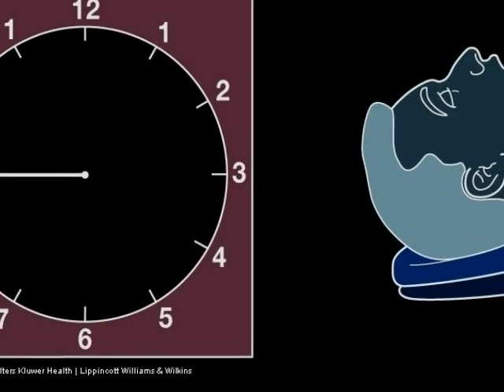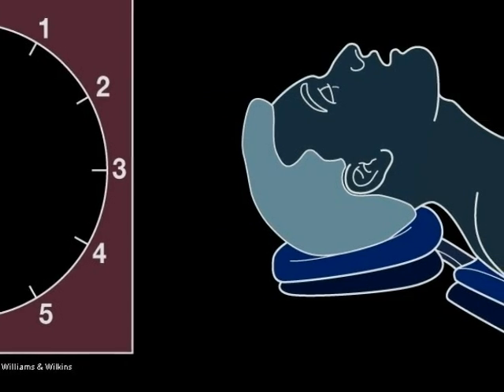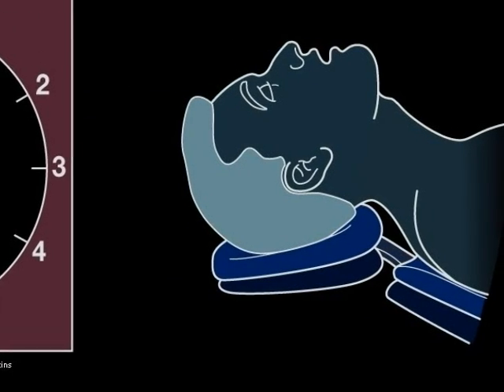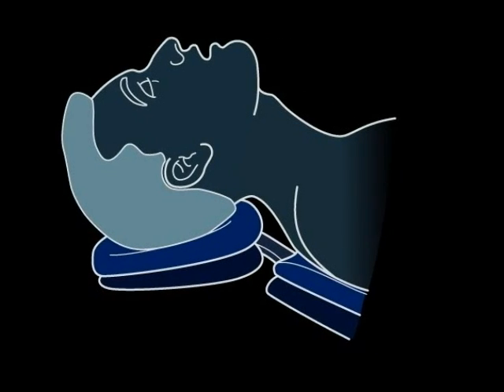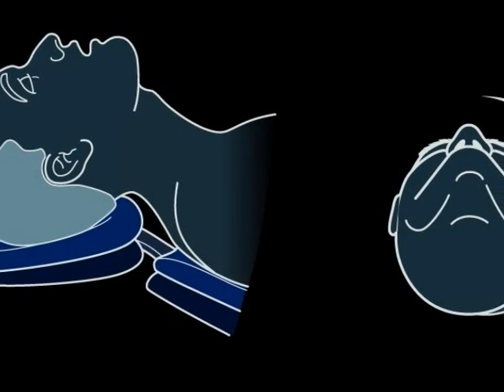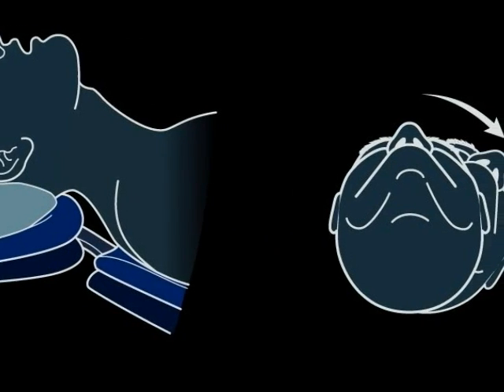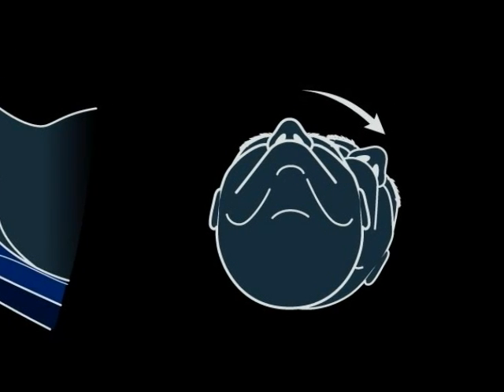9 o'clock is the position that the operator will sit for the maxillary posterior surfaces towards you. You will ask the patient to tilt their head slightly back and slightly towards you. This is the position for the maxillary surfaces towards the operator.